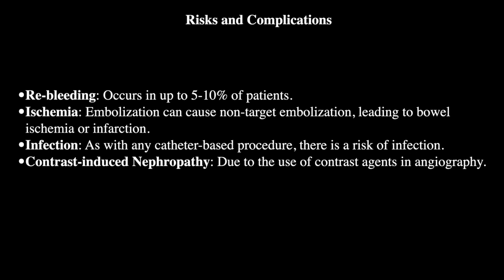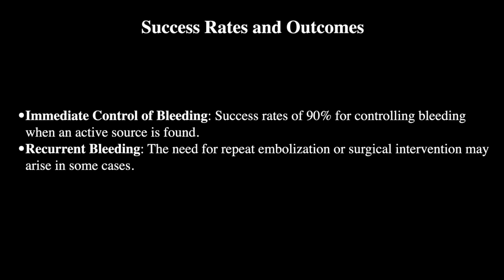Now what are the risks and complications? There could be rebleeding. However, it occurs rarely, around 5 to 10%, depending on the case. If we embolize another vessel or a normal vessel, that can lead to ischemia or infarction of the bowel. Infection is possible and nephropathy can be possible because we use a lot of contrast agent in the angiography.